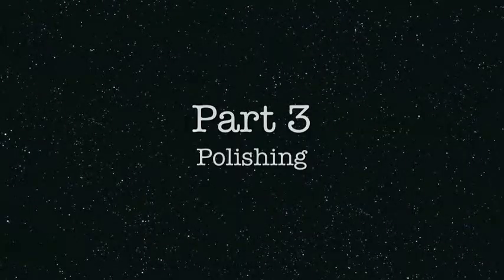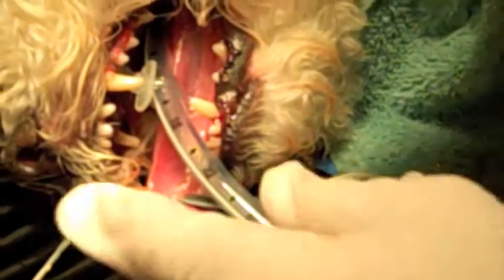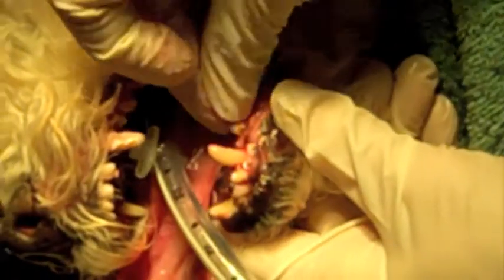Okay, so the next step after that, if everything looks okay, is to polish the teeth, which you also get done at your dentist's office. We usually rub the polish right on the teeth, where they usually will put a small amount in the cup that polishes. Sometimes we will do that also, but usually put a little bit on the teeth.